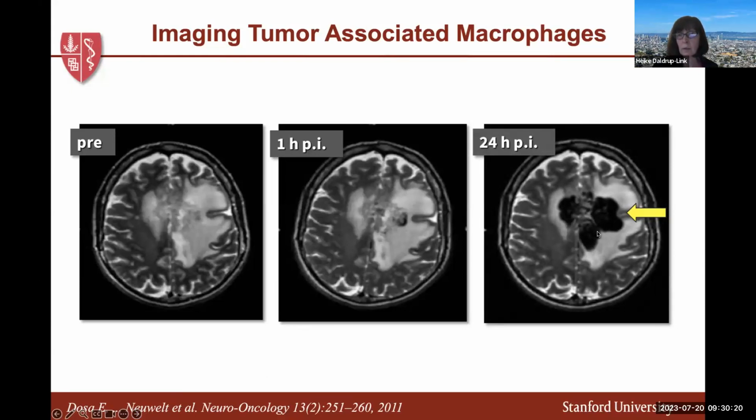of the nanoparticles by the tumor tissue. The surrounding bright rim here is the edema around the tumor. And I think this series of images shows very nicely that there is a very slow leak of nanoparticles into the tumor tissue. And so you really need a 24-hour scan if you want to look for macrophages in the tumor tissue in patients.